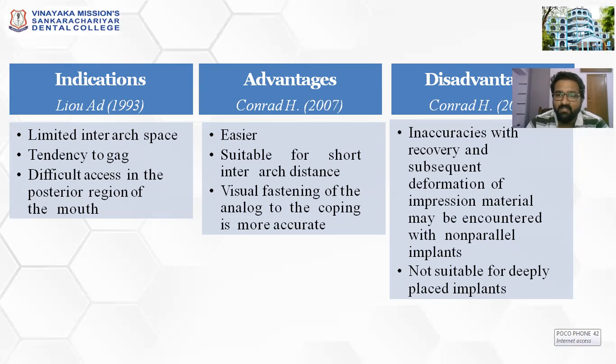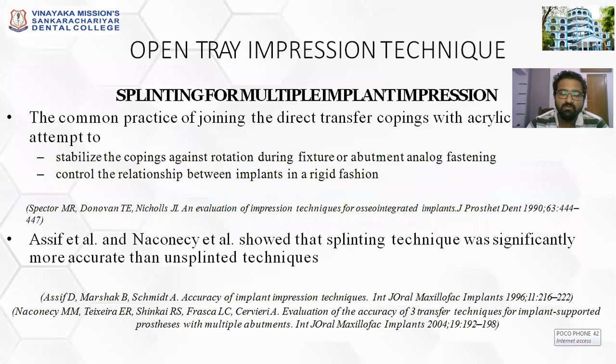What are the disadvantages? Disadvantage always is surrounded by inaccuracies. This type of impression you take for an implant is always inaccurate. So it is not suitable for deeply placed implants, that is subcrestally placed implants. Okay. So coming on to open tray implant level impression.